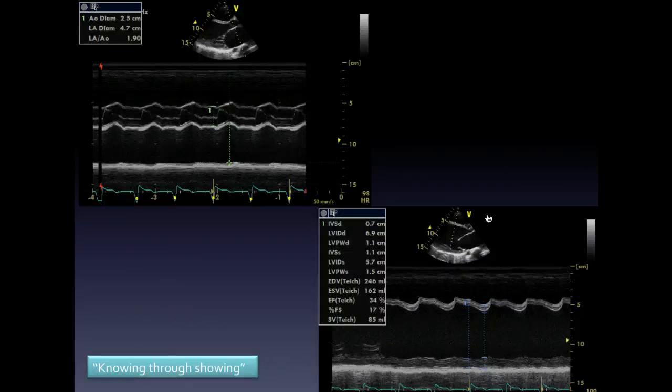So then we take the aforementioned M mode, and the M mode is extremely useful. This is the M mode here with the area of interest put across the atrium. What I didn't mention, what is extremely important, is that if the atrium is big, that implies certain things. This atrium is big. If the atrium is big, what that is telling you is that, for example, the patient's in long-standing atrial fibrillation, you have an atrial remodeling. That's not going on here.